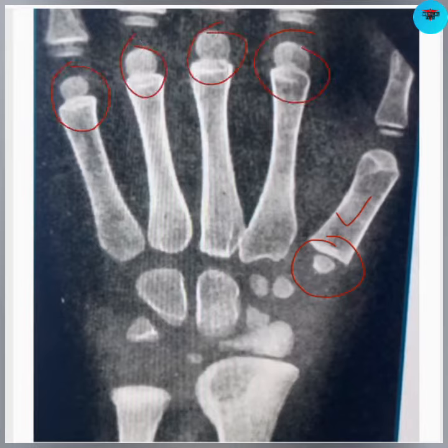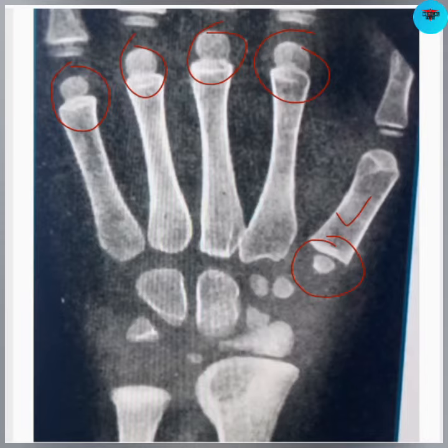So this epiphysis at the base of the first metacarpal, we call it the aberrant epiphysis, which is different from the other metacarpals. Aberrant epiphysis means a deviation from the normal — this is not the normal position.